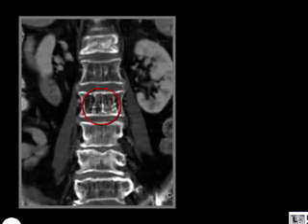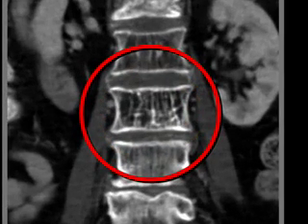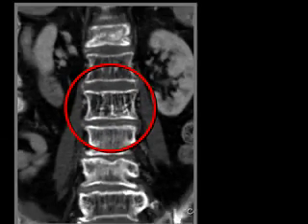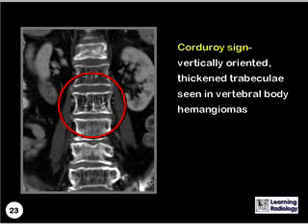What sign is this? This is the corduroy sign, which are the vertically-oriented, thickened trabeculae seen in hemangiomas of vertebral bodies.